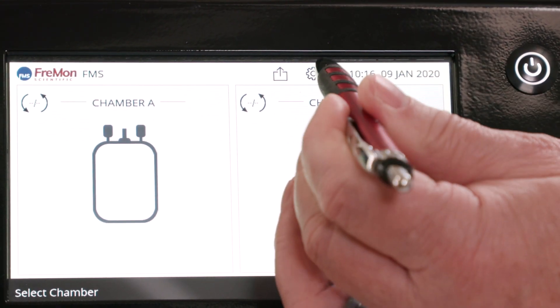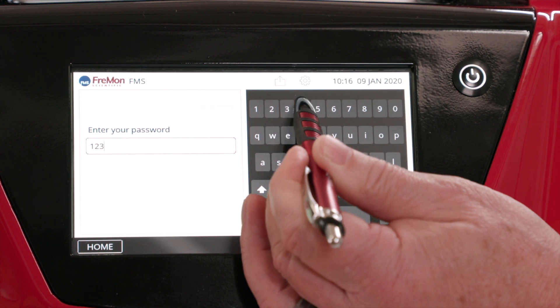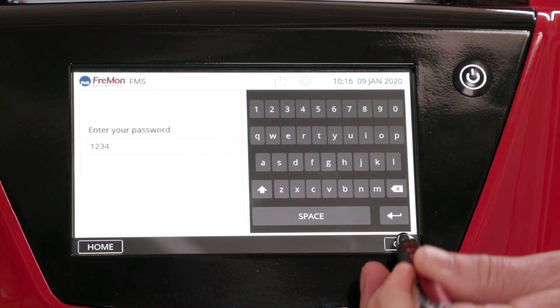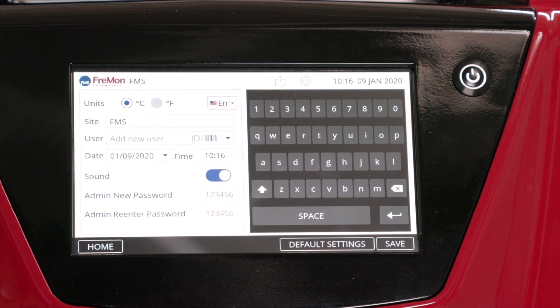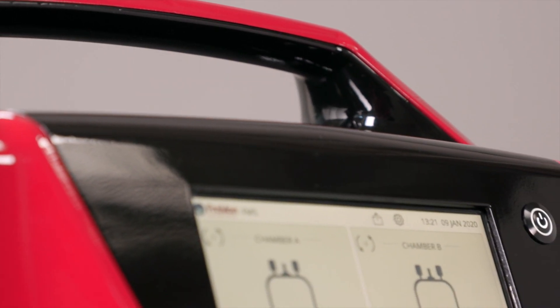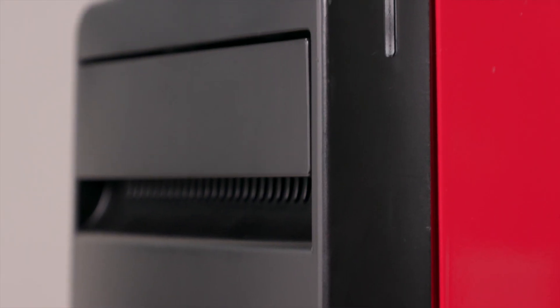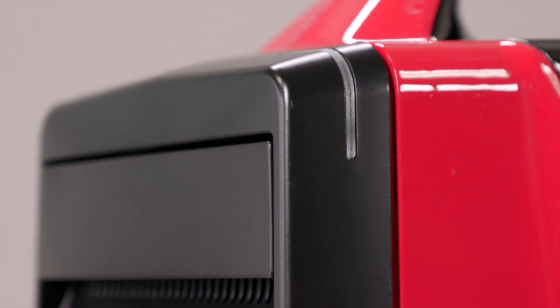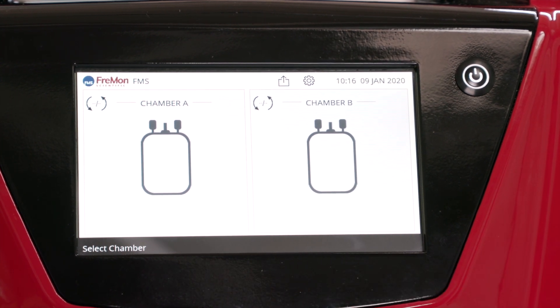We'll hit settings to take a look at the preferences and users — looks good. Now you're ready to Zipthaw.